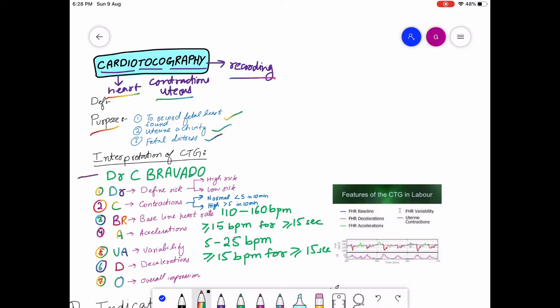To interpret the CTG, just memorize this formula: DR C BRAVADO. Each word stands for something — DR for defined risk, C for contractions, BR for baseline heart rate, A for acceleration, VA for variability, D for deceleration, and O for overall impression.